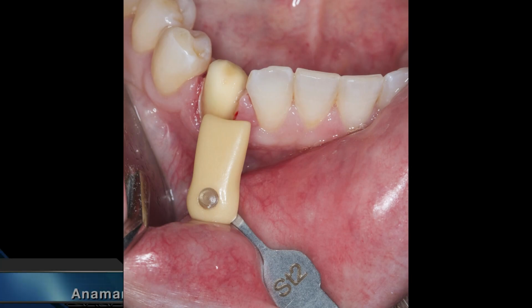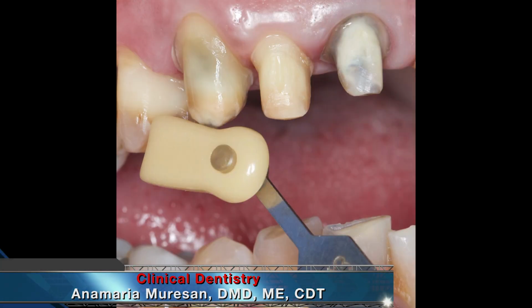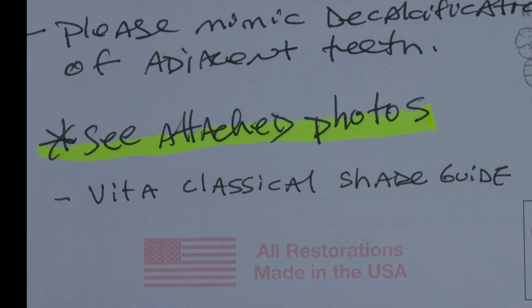It also won't be a problem to use a standard Vita guide or a similar system as long as the system that is being used is clearly noted on the photos and in the RX form.